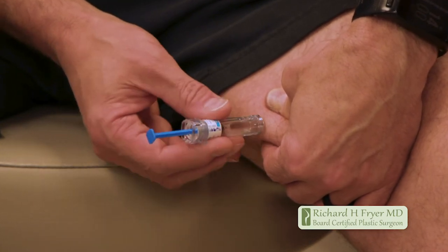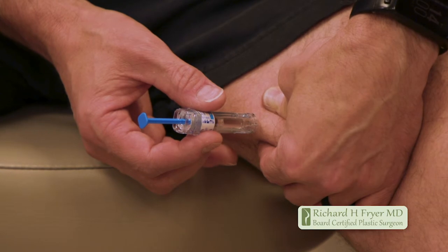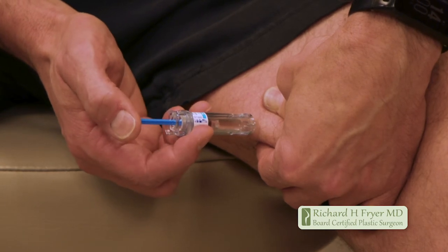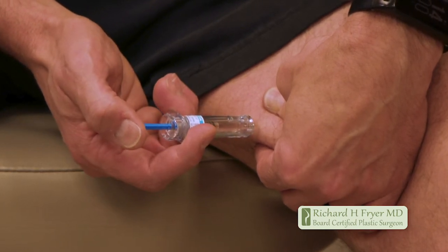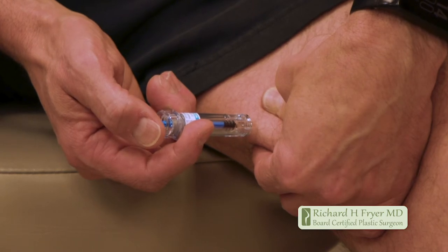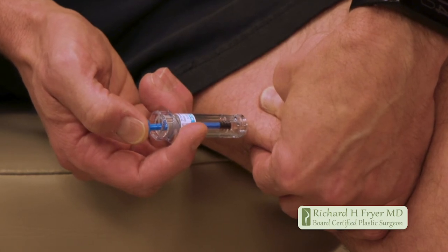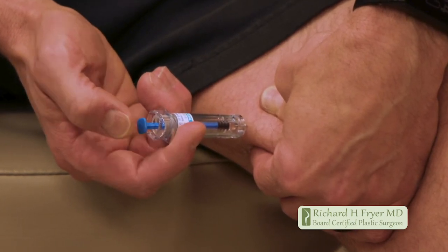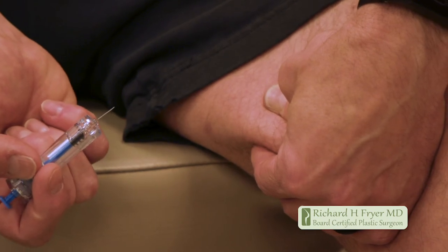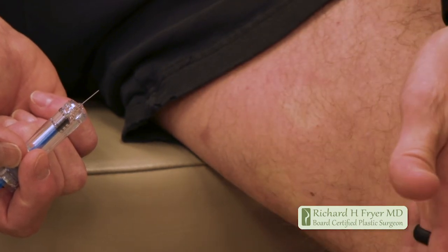Here we go — there's the needle. I honestly did not really even feel the needle; felt a tiny something. Now as you inject, this particular medication does have a little bit of a sting — it shouldn't be surprising, but yes, a little sting. Press the plunger gently to inject into the tissue, then withdraw the needle. Not bleeding — usually don't need a band-aid; just let the tissue relax.